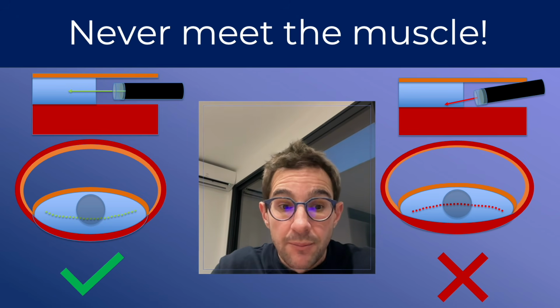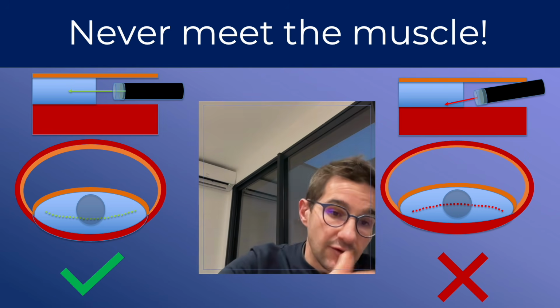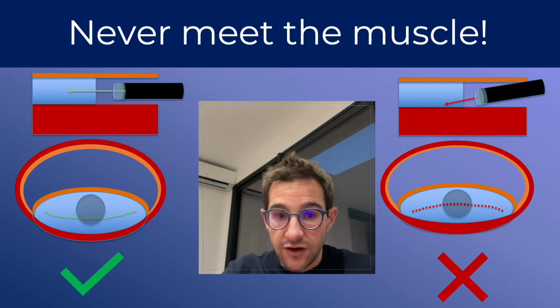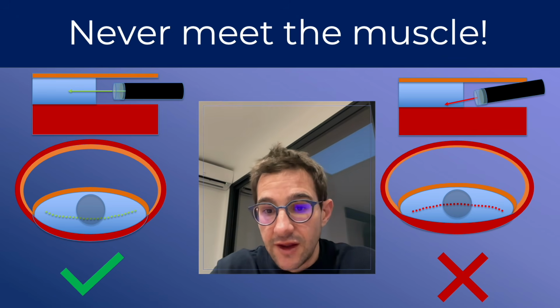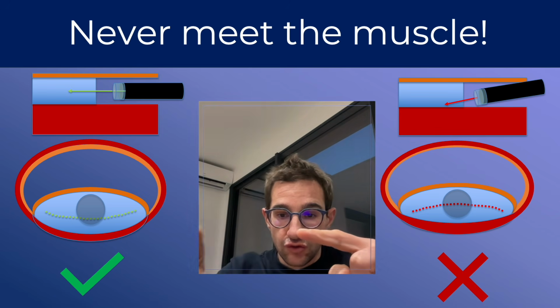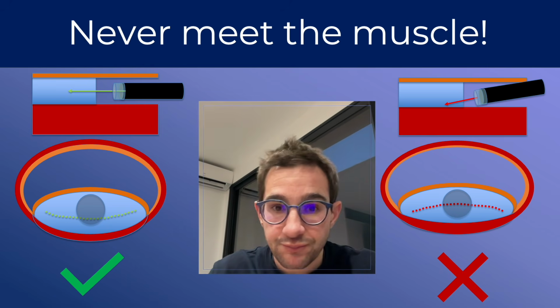It means that you are doing a line that follows the muscle in a horizontal view but also in a circular view due to the shape of the bowel, and it will never go to the muscle. It means that the line of your cut should never go to the two edges and cut the muscle.